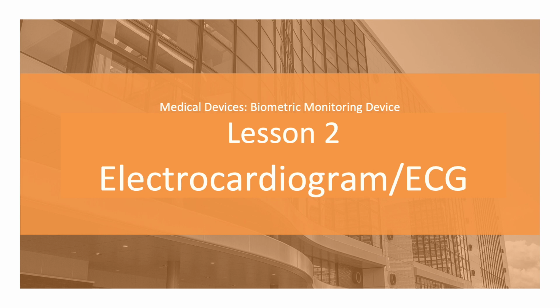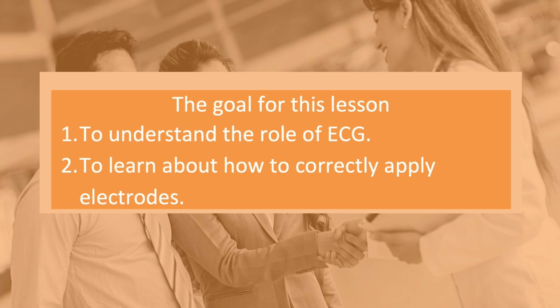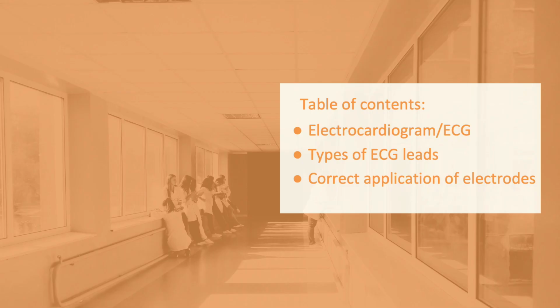Medical devices, biometric monitoring devices, Lesson 2, Electrocardiogram, ECG. This unit covers the basics of medical devices. The goal for this lesson is to understand the role of the electrocardiogram and learn about how to correctly apply electrodes. This is the content of this lesson.